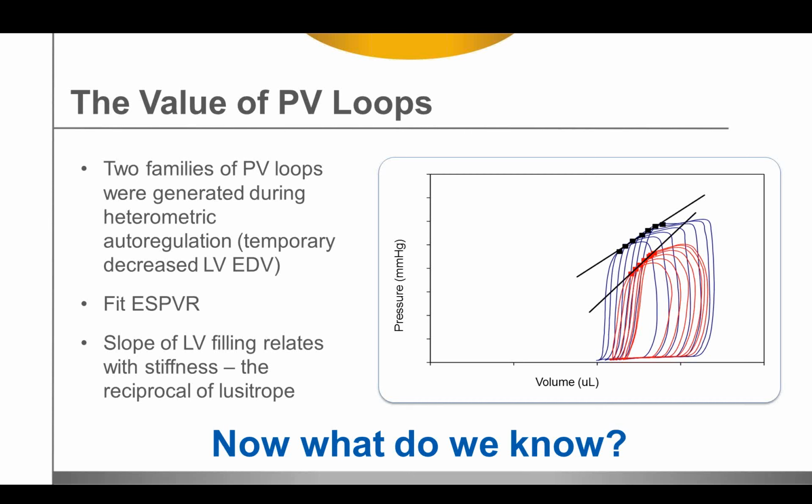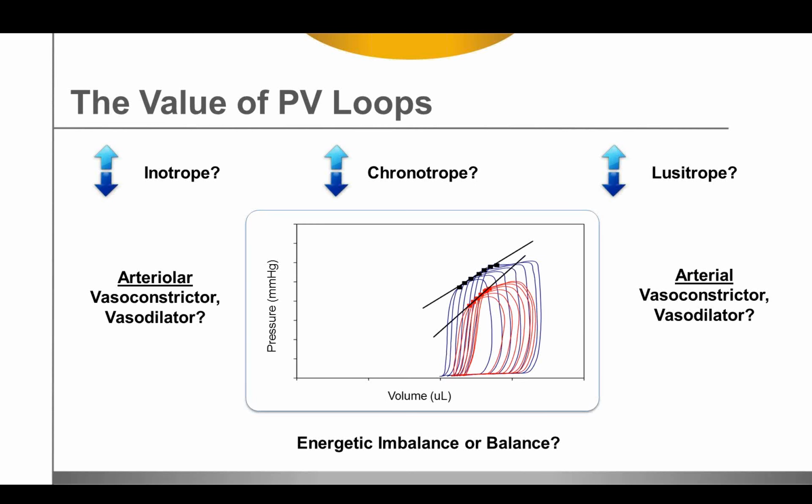I don't say it is preload independent, although it is preload dependent, because contractility cannot be measured unless both preload and afterload are known, and we believe that pressure volume loops are good for this. So we ask the question, what are the properties of this test article? And the other question, very important to the pharmaceutical industry, what are the consequences of not knowing these properties?